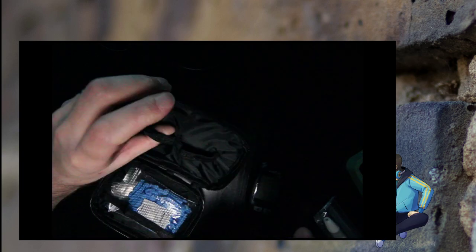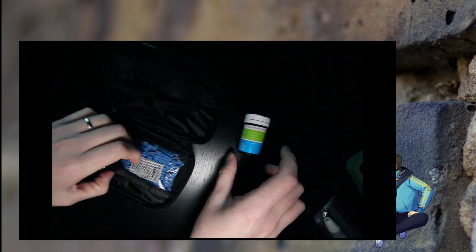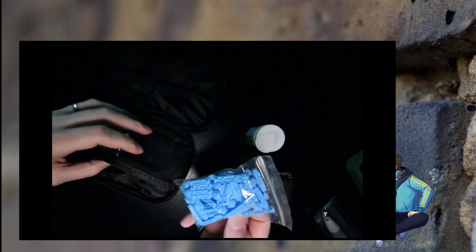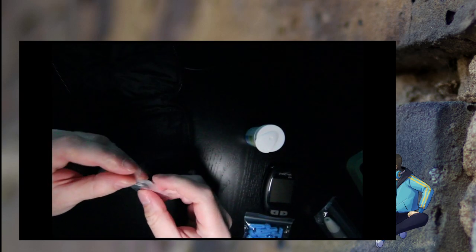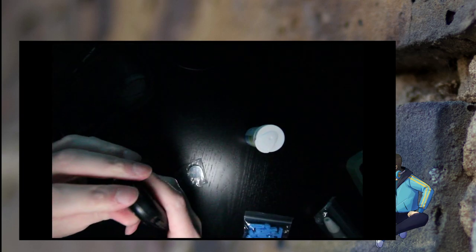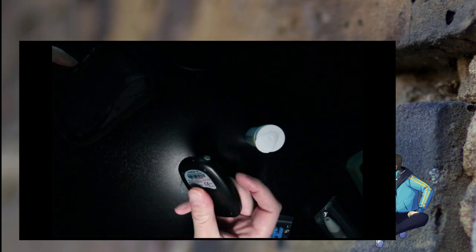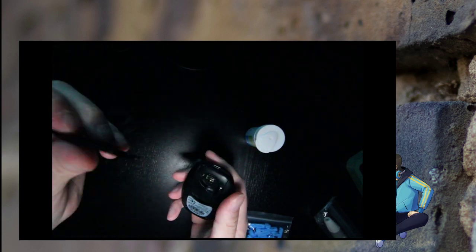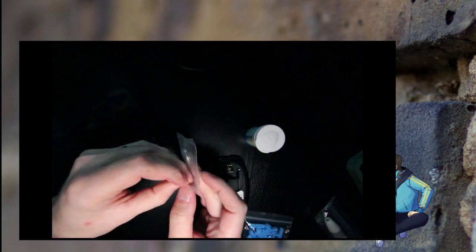Comes with the test strips. Good quantity of test strips as well. Comes with a spare battery. Or is that the only battery? It's a CR2032, so that's usual. Let me take this away. Yeah, that's the only battery. So it comes with one battery, no spares.